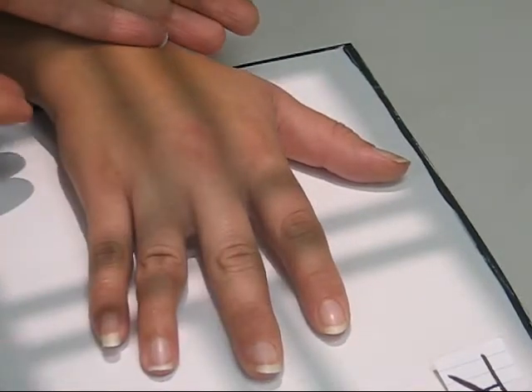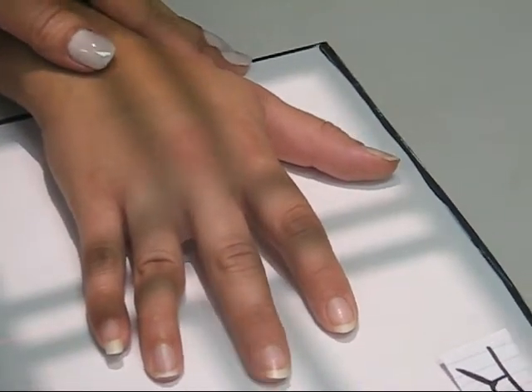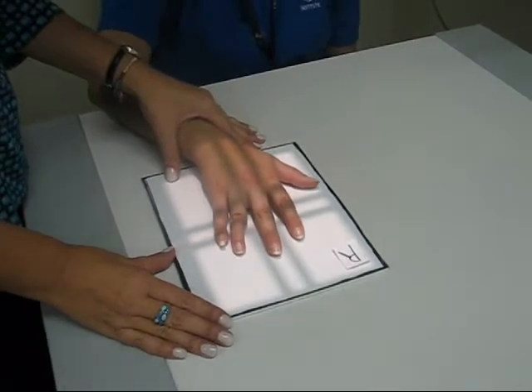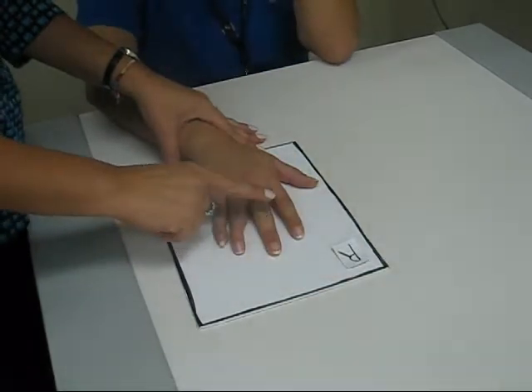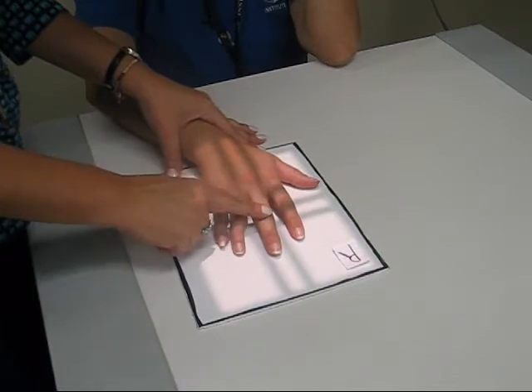If it's all the fingers that you're looking for as interest, you have to include the metacarpal, so you might as well just do the entire hand. If it's for a finger individually, the central ray is going to be right in the middle joint of the finger, right in the middle over the knuckles.